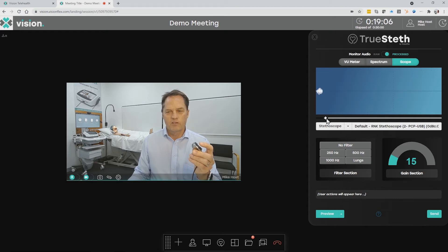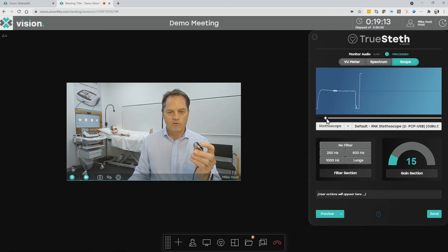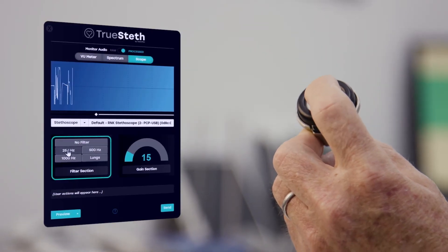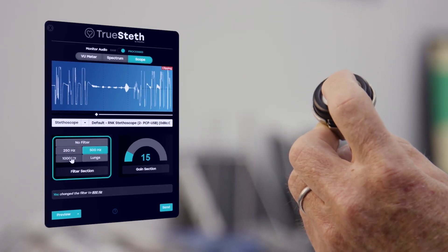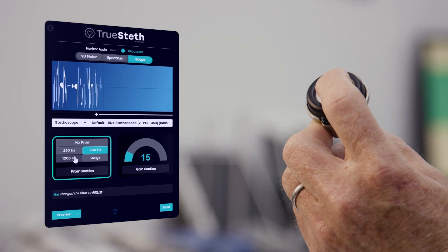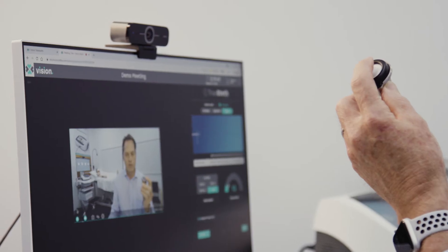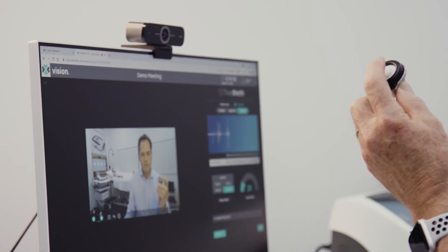This is fantastic for diagnosing heart sounds and lung sounds — to really see the shape of that stethoscope signal as you apply it. Down below we have the filter settings: 250 and 500 hertz, which are used for heart sounds and the higher frequencies, and then we have the lung filter as well for listening to lung sounds.